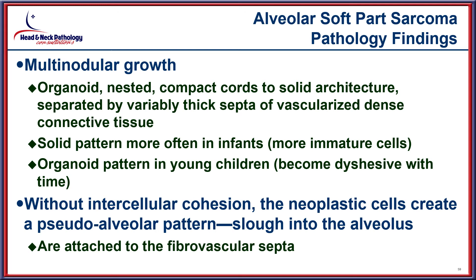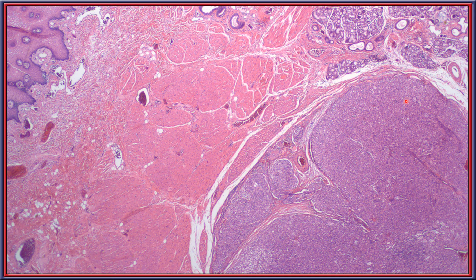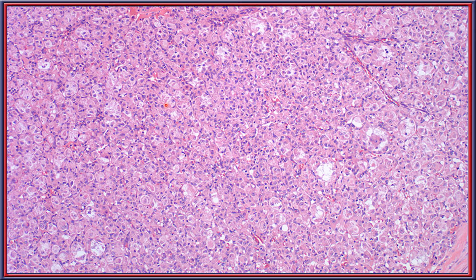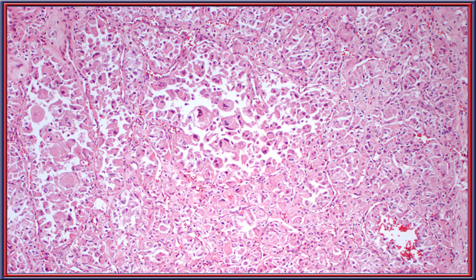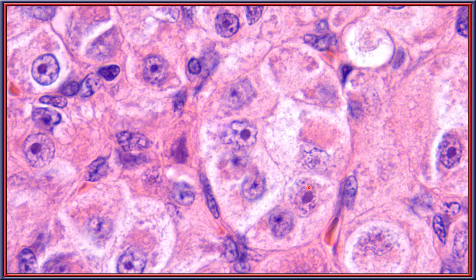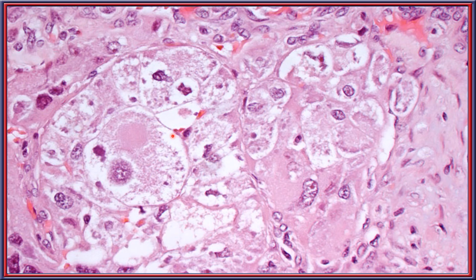Alveolar soft part sarcoma typically shows a multinodular growth with an organoid or nested pattern, more solid in earlier lesions and organoid as it becomes more dyshesive in younger patients, resulting in a pseudo-alveolar pattern in the center. There is an intact surface epithelium with lobules of neoplastic cells deep in the stroma separated by a well-developed fibrovascular stroma. The large polygonal cells have one or more vesicular nuclei and prominent nucleoli, but tend to show mild pleomorphism, scant mitoses, and very rare necrosis. High power demonstrates large cells with both high and low nucleocytoplasmic ratios and abundant eosinophilic cytoplasm.